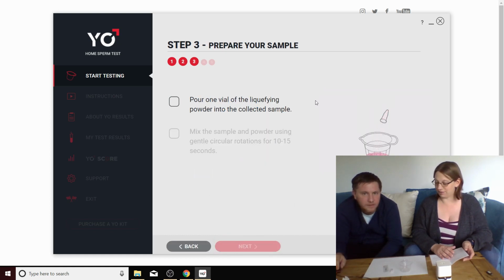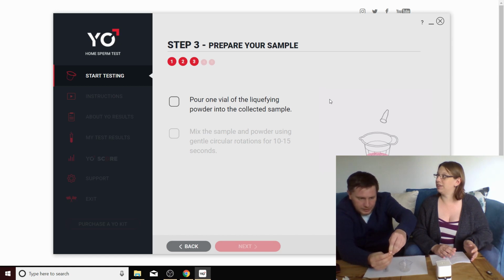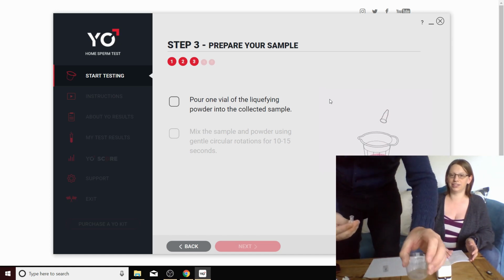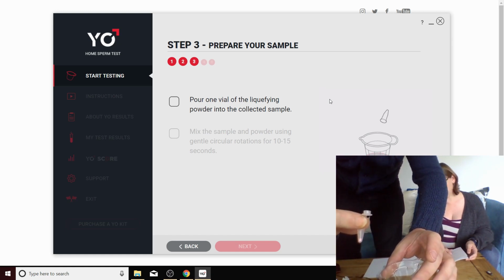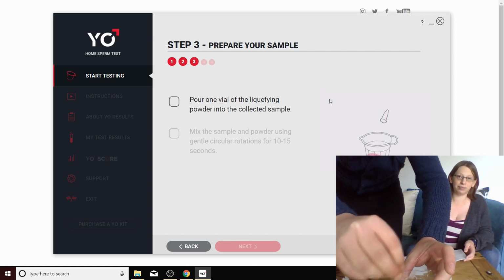Okay, so pour 1 vial of the liquefying powder into the collected sample. So it comes in this little tube. You click it up. Do you want to show it closer to them? Yeah. It's a really tiny screen. I'll try not to bring my sample too close. But you've got the little powder, which if I move my fingers you can see, it's a tiny little bit of red powder in the base, which we then pour all of it in there.